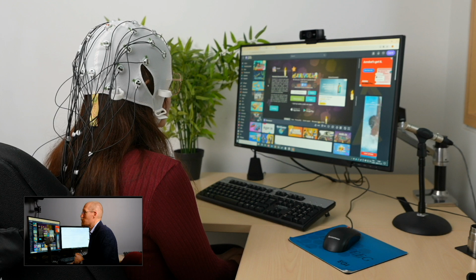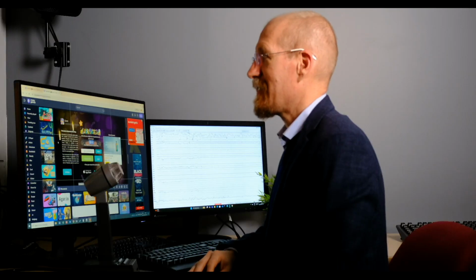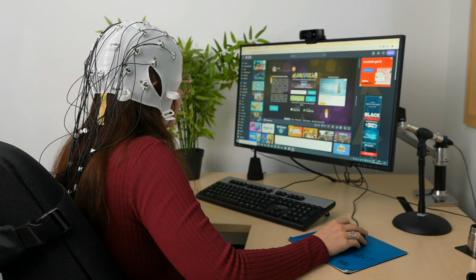Anne, are you ready to try? Yeah, I am. Okay. You have the mouse? Yeah. Okay. Please go ahead and click play as guest.